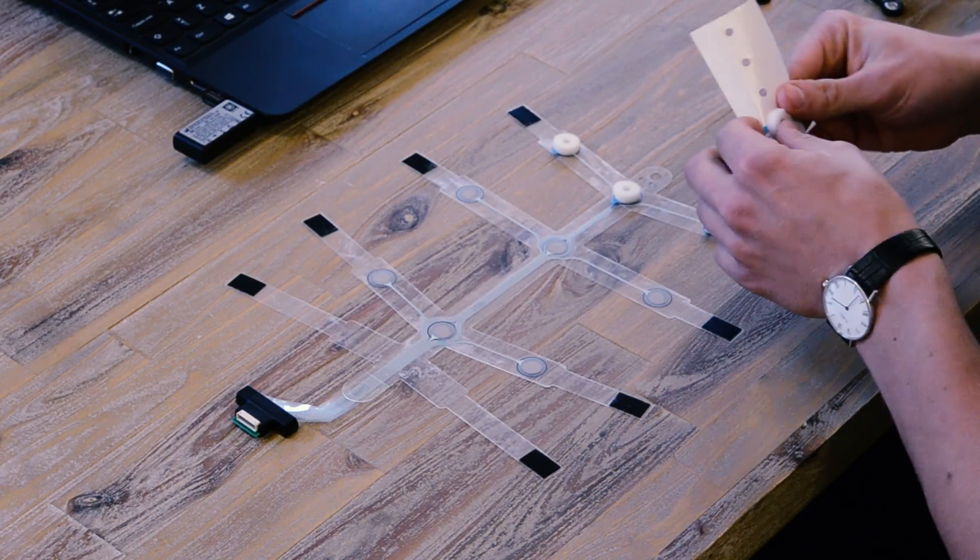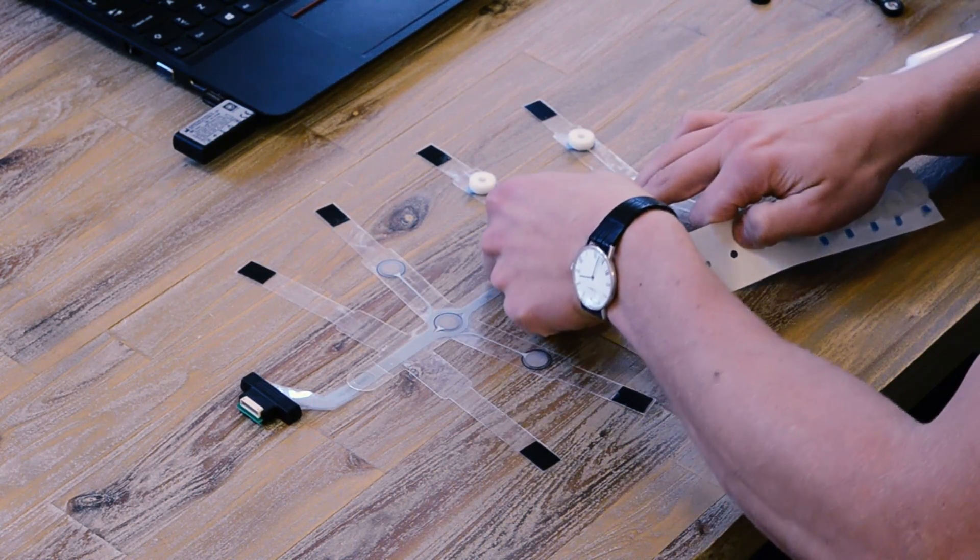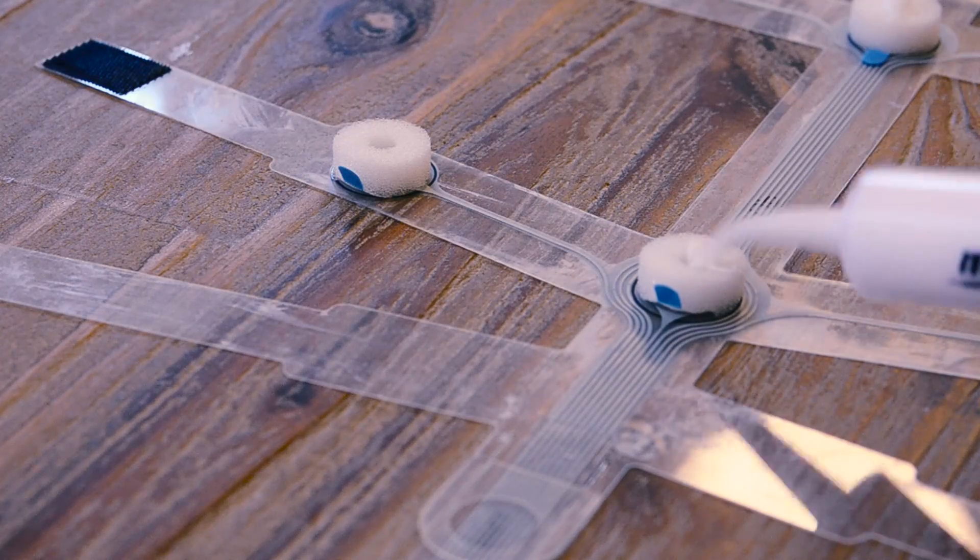First, we apply small pads to every passive electrode on our EEG strip and fill them with a special kind of conductive cream.